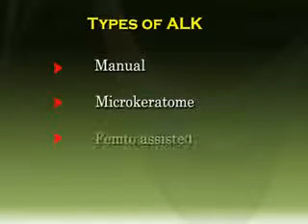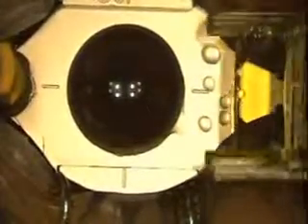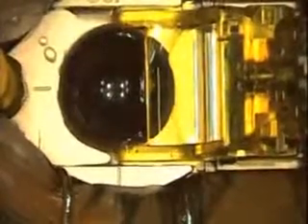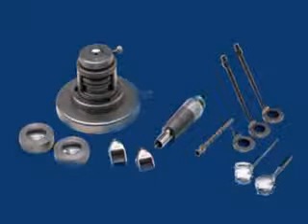Anterior lamellar keratoplasty can be performed either by manual dissection, microkeratome, or using femtosecond laser. Microkeratome ALK, which can give promising results, has certain major limitations. The thickness of the tissue dissected by the microkeratome would depend on the speed of the pass as well as the amount of suction achieved. Both being variable factors can lead to graft-host discrepancy. This often results in the need to apply sutures, which offsets some of the advantage gained. The small selection of microkeratome heads also limits the choice for depth of the recipient bed.